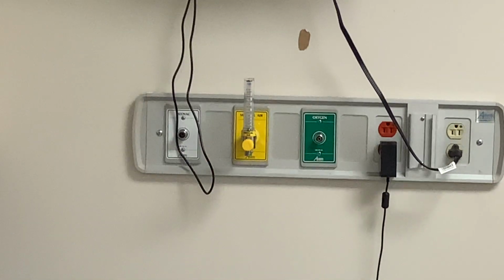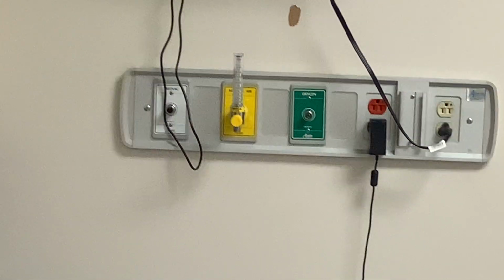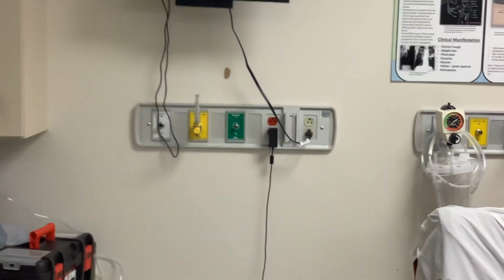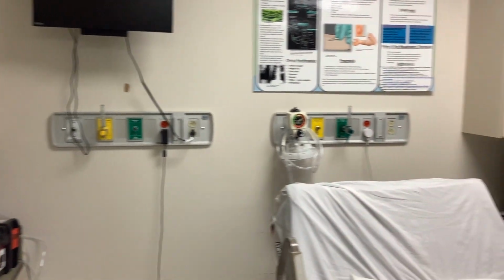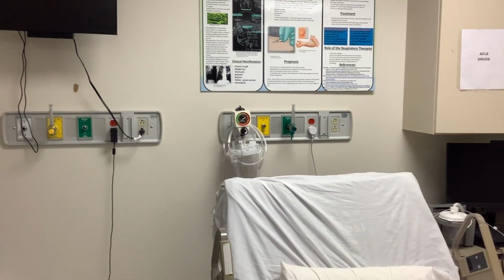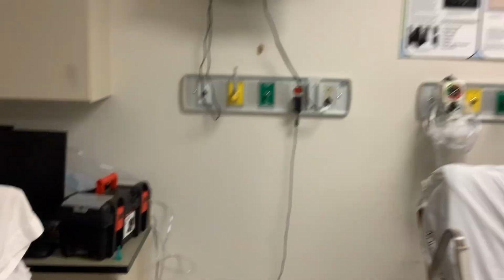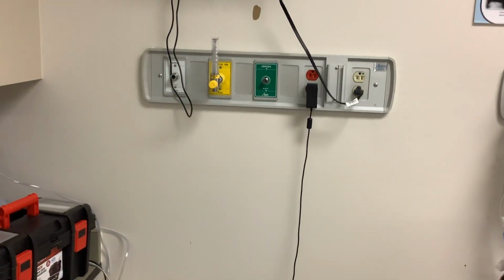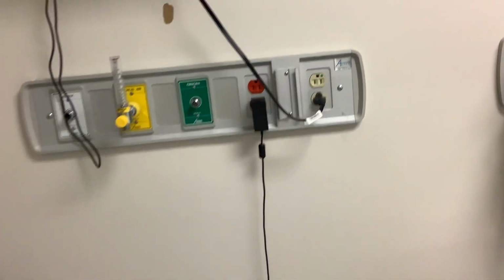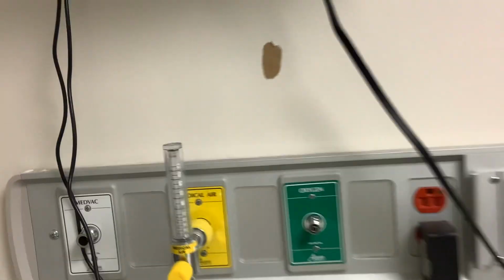So you cannot provide any higher than 21% if you are utilizing an air flow meter. You can utilize more than 21% if you're utilizing an oxygen flow meter, because it is 100% oxygen that's coming from the wall. So that's going to be important for us to remember. Those are Thorpe tube flow meters. Your Thorpe tube flow meters can also be pressure compensated or pressure uncompensated. One way you can tell the difference in that is the position of the needle valve.